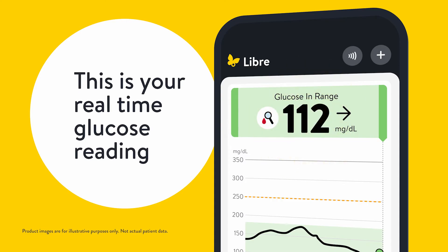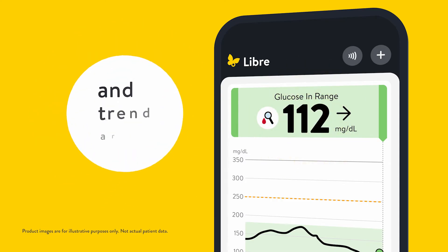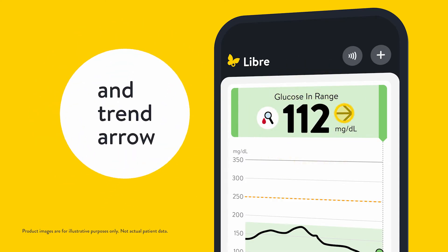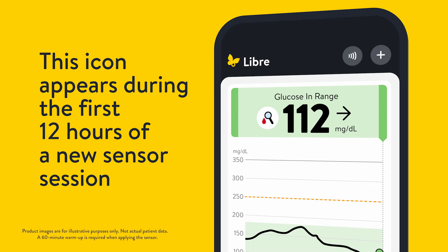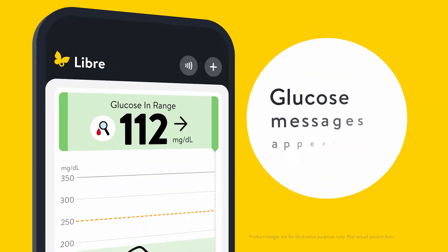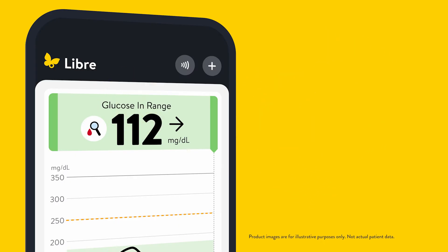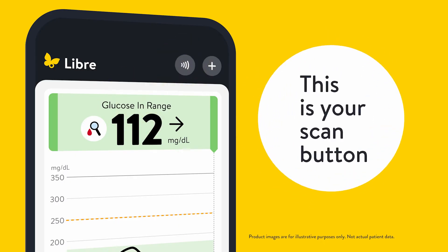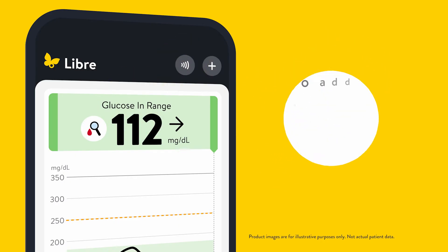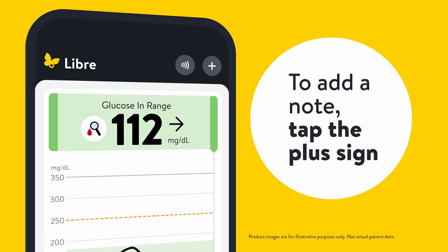This is your real-time glucose reading and trend arrow. This icon will only appear during the first 12 hours of a new sensor session. Your glucose messages appear here and this is your scan button. To add a note, tap the plus sign.